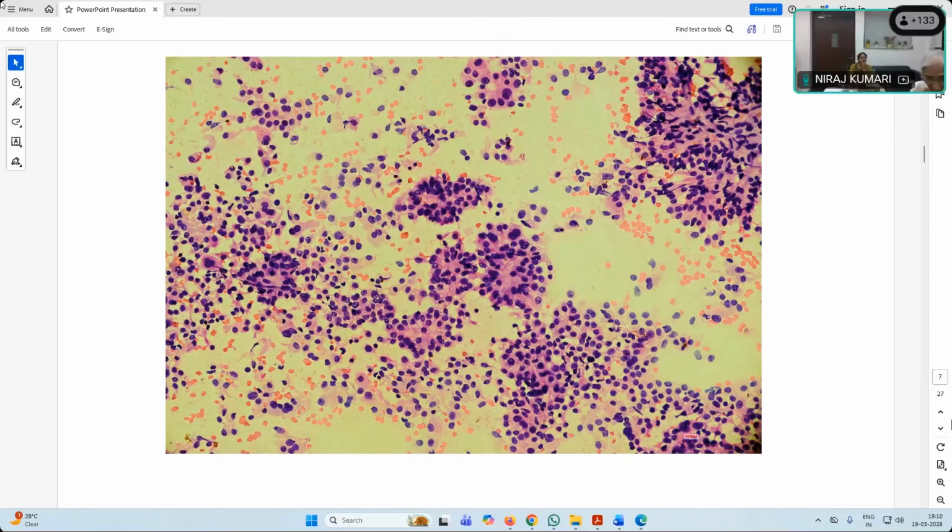Any Dr. Preeta? Metastasis either from a breast papillary carcinoma. So this is a cervical lymph node. Okay. So it has to be largely metastatic. Primary, we don't expect in a lymph node, no? So it is metastatic. So you said medullary possibilities like thyroid. Second, you said breast. Okay.